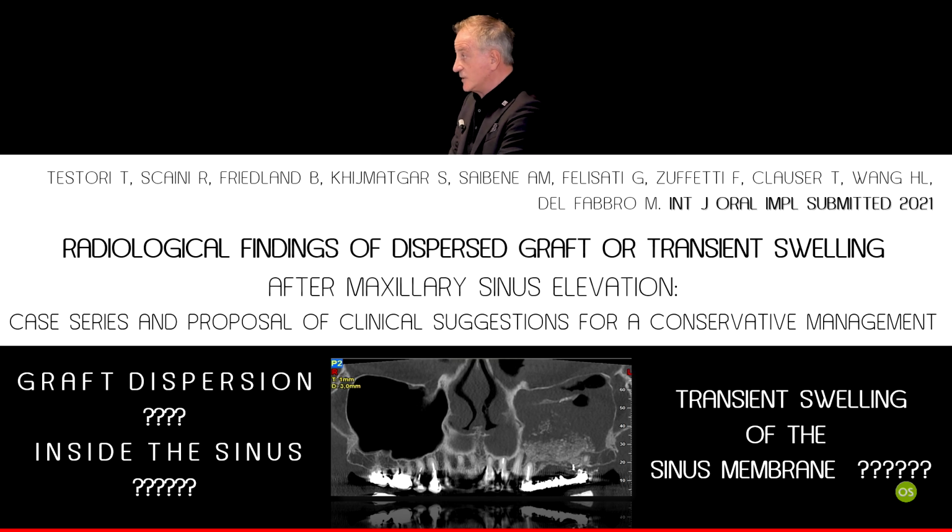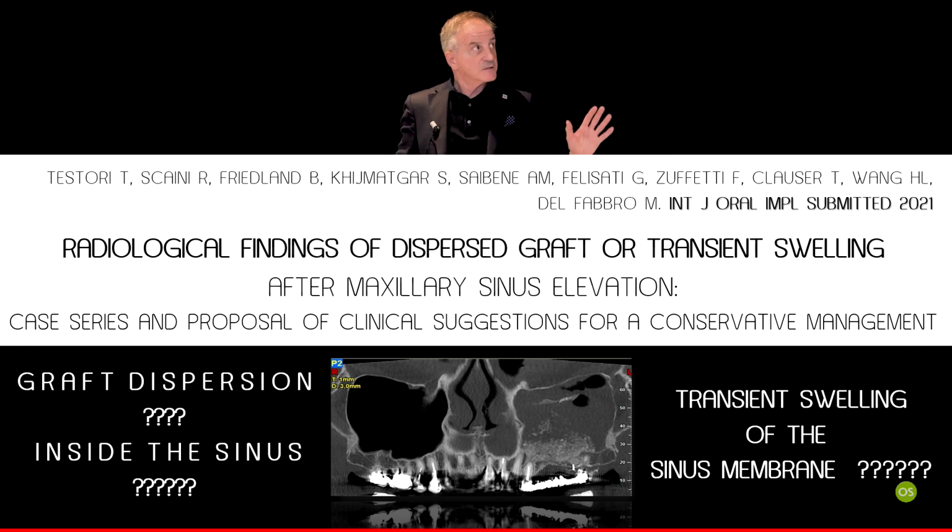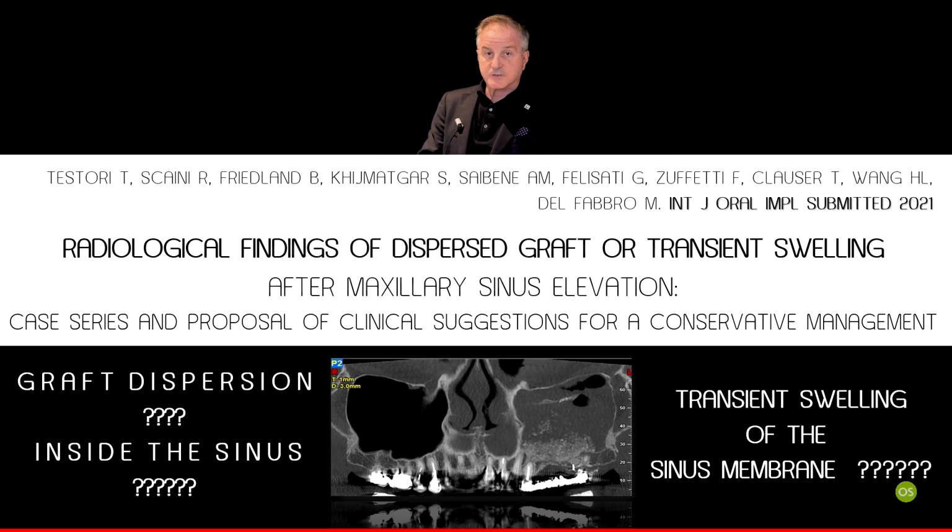This is not submitted. It's already accepted. So we have all these publications. Radiological finding of dispersed graft or transient swelling. To let you understand a little bit about this publication, Friedland is a maxillofacial radiologist from Harvard.